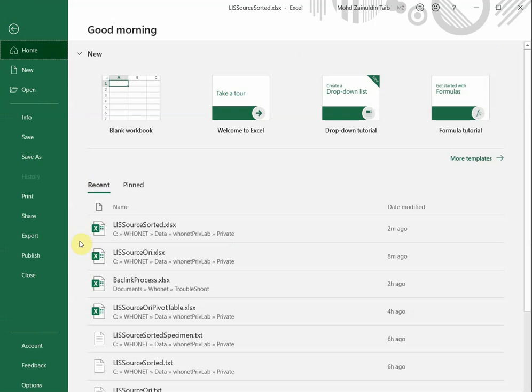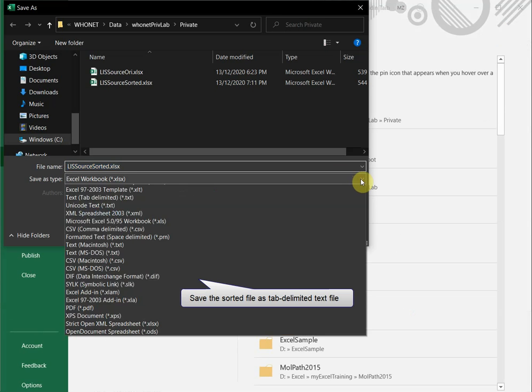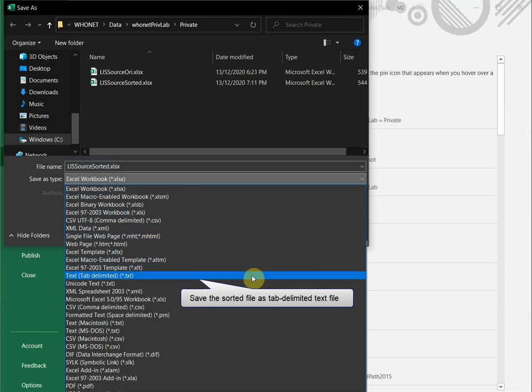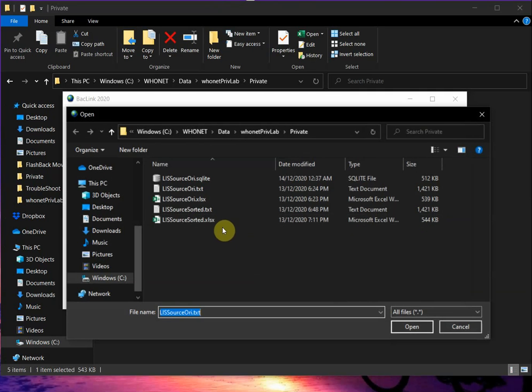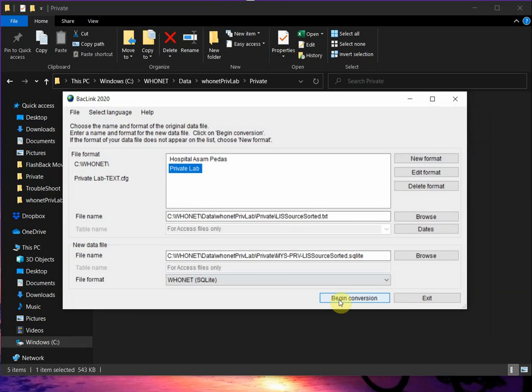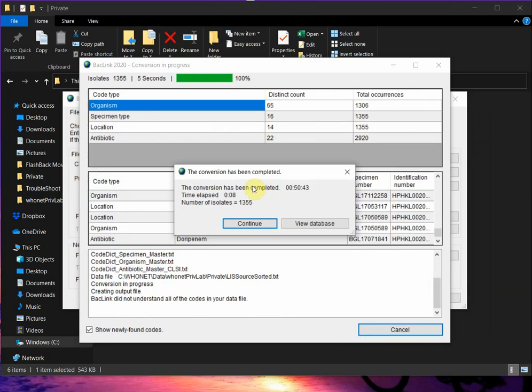We need to save as. We change this to tab delimited. Go back to BacLink. Now we repeat with the sorted source file. Begin conversion. In the sorted file, the final isolate count is 1355.